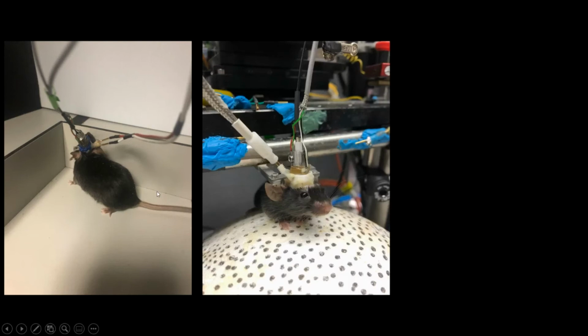Even if I electrically shielded it, it was still a problem. And here's my ultrasound cable as well. And you can see that I have these little head bars, and I have an ultrasound bracket on the animal's head. So it becomes a lot easier to work with, much lower noise when you've head-fixed the animal. So here's an example of a system that you can just buy off the shelf.